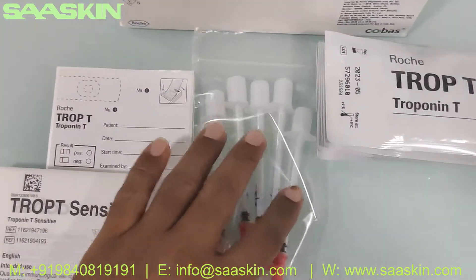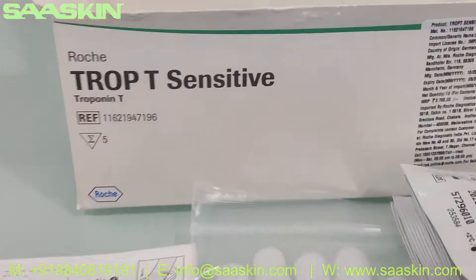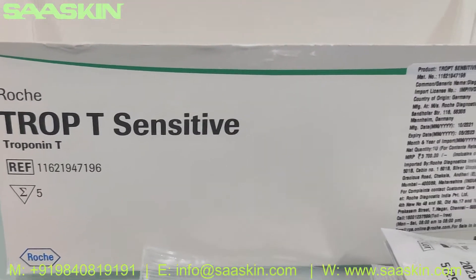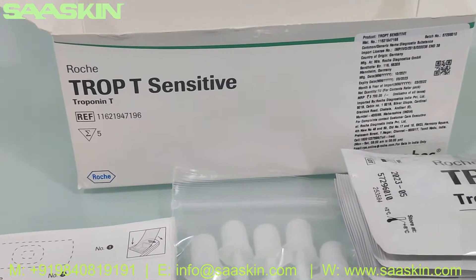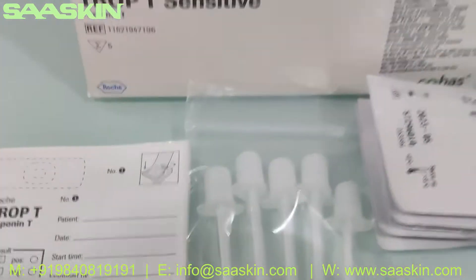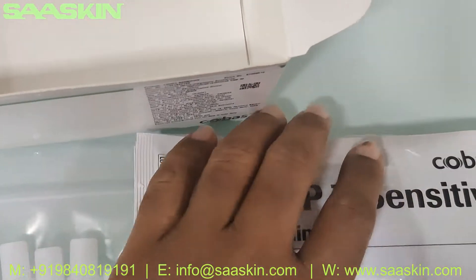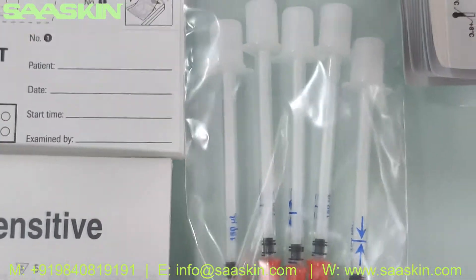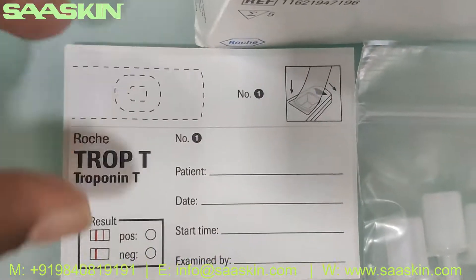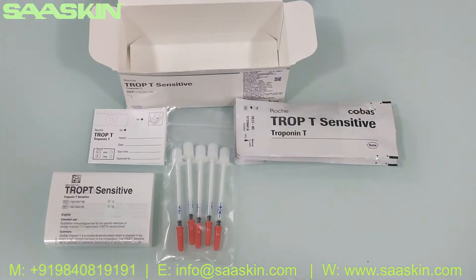Here is a quick summary of this box: this is the Roche troponin T sensitive test kit, used for the qualitative detection of troponin in anticoagulated venous whole blood. In this five-test kit box you get five test cassettes, five pipettes for blood collection, five patient stickers, and five IFU brochures. That is how the whole test kit looks.